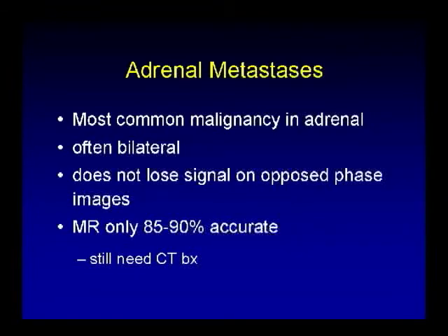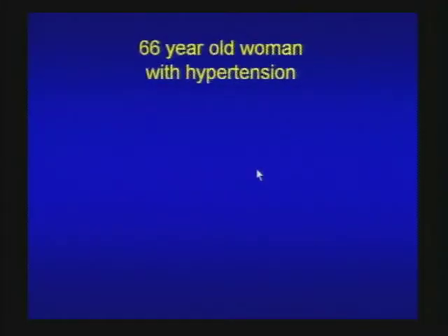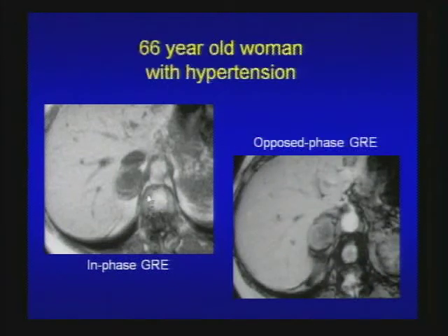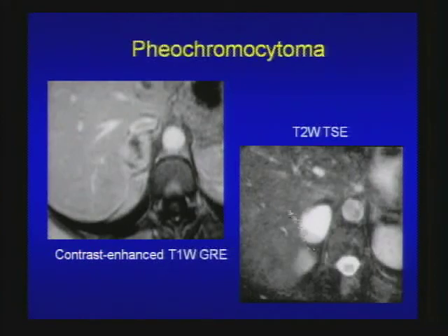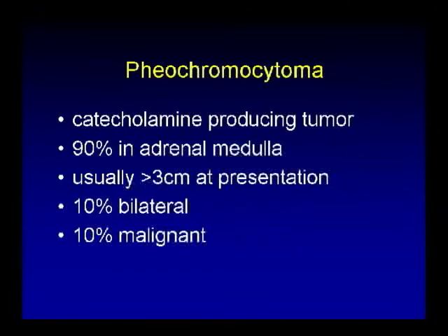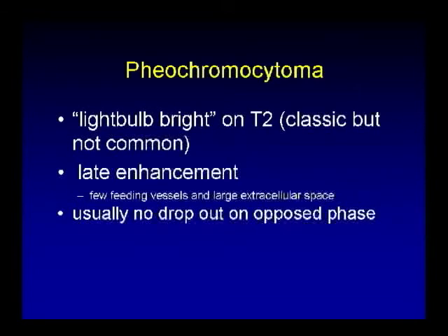Here's our next case: 66-year-old woman with hypertension. T1 in and opposed-phase image shows a right adrenal gland mass with no signal dropout compared to skeletal muscle — not typical for adrenal adenoma. Contrast-enhanced image shows heterogeneous enhancement and it's very bright on T2-weighted image — in fact light bulb bright — typical for pheochromocytoma. Pheochromocytoma is a catecholamine-producing tumor, 90% in the medulla, usually greater than 3 cm at presentation. Remember: 10% can be bilateral, 10% malignant. Light bulb bright on T2 is classic but unfortunately not very common. They demonstrate late enhancement due to large extracellular space and usually no dropout on opposed-phase imaging compared to adenoma.